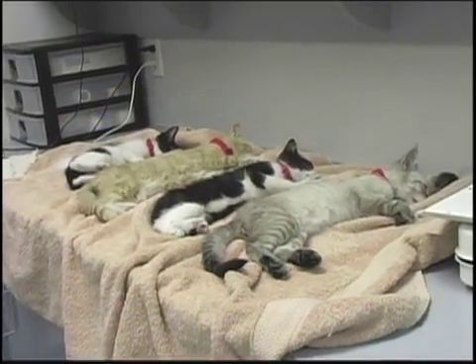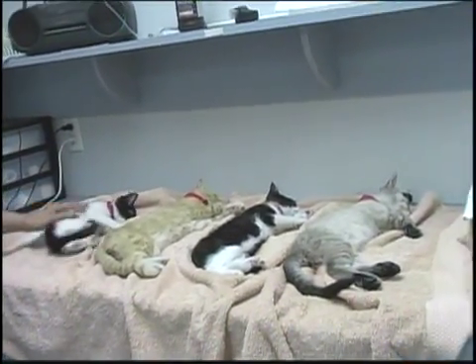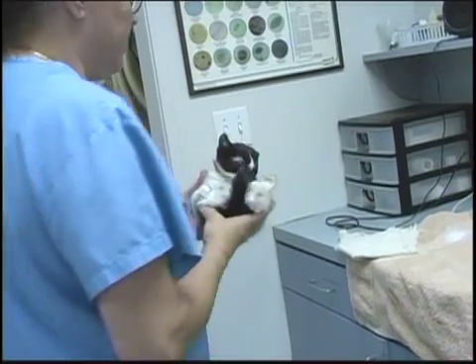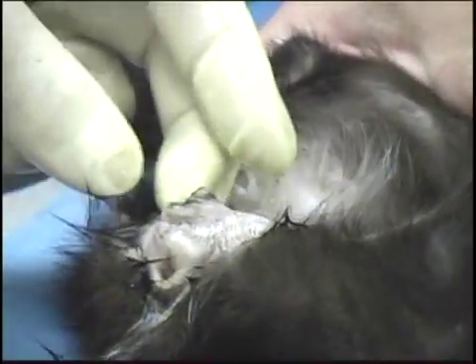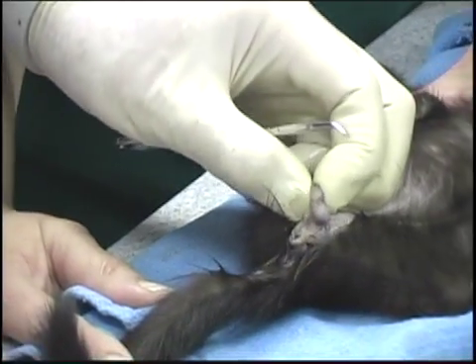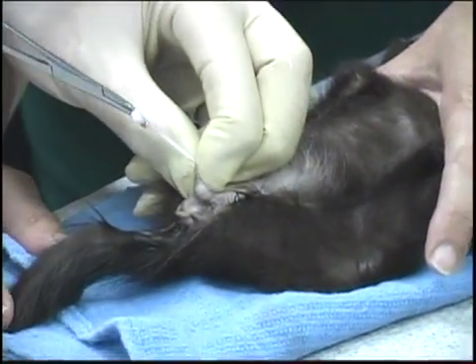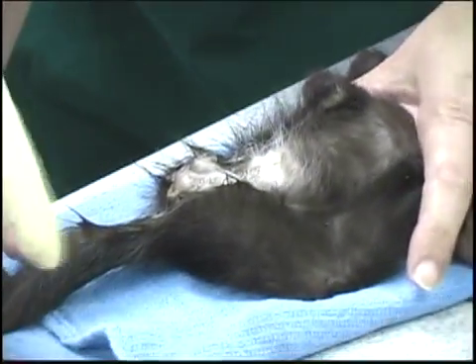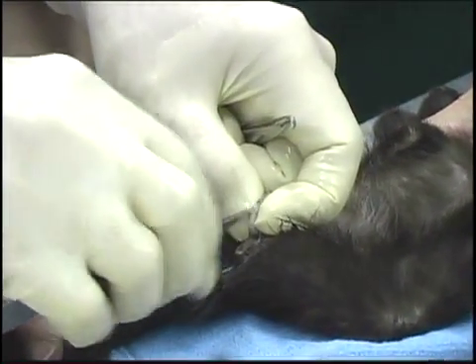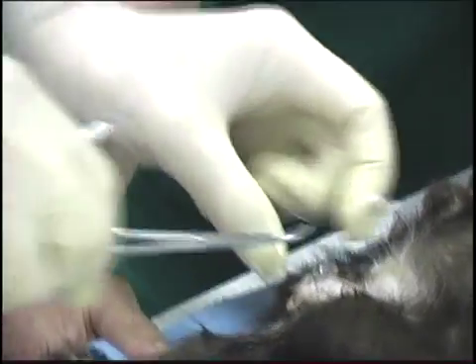These are technically closed castrations that I am doing, not open castrations. How soon do you think they will be awake? This one is jumping around — it has been about one to two minutes. It depends on the cat, but within five minutes. On these very small kittens up to about eight, maybe nine weeks — this one is probably about six weeks — do not use any ligature ties on them. Simply take them and by slow digital extraction, that is all that is necessary.